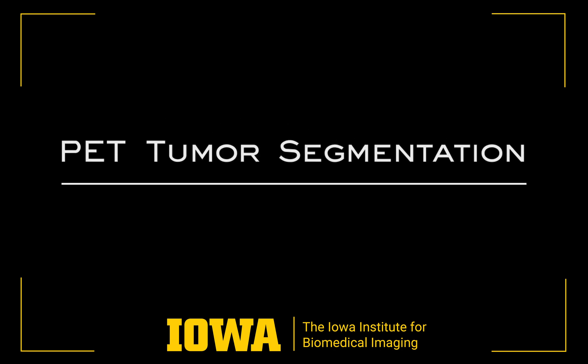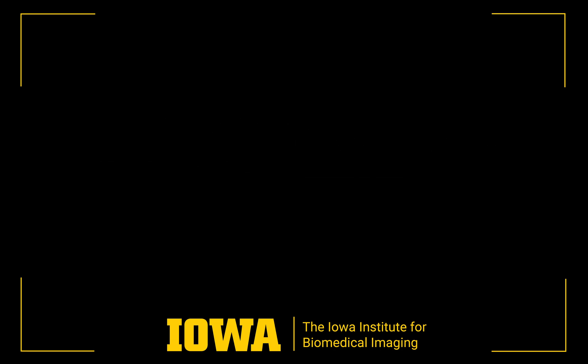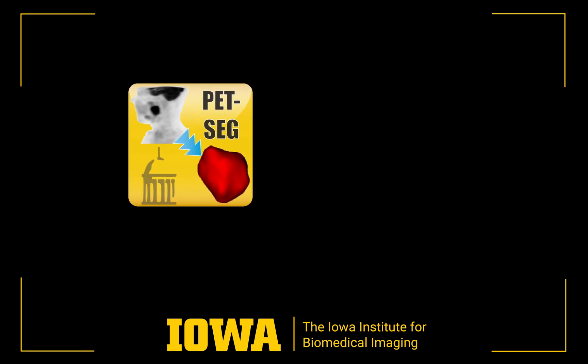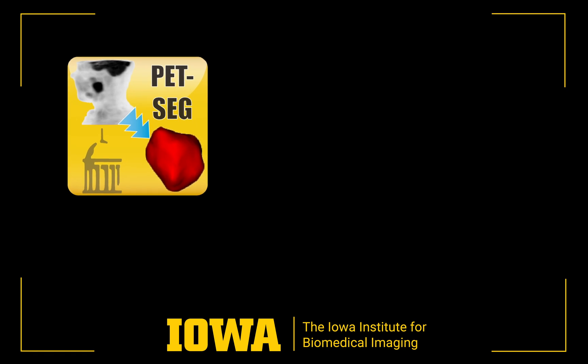In this video, we are looking at the PET Tumor Segmentation Extension for 3D Slicer, a multi-platform, free and open-source software package for visualization and medical image computing.